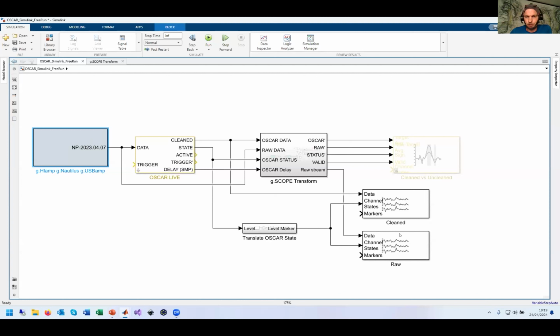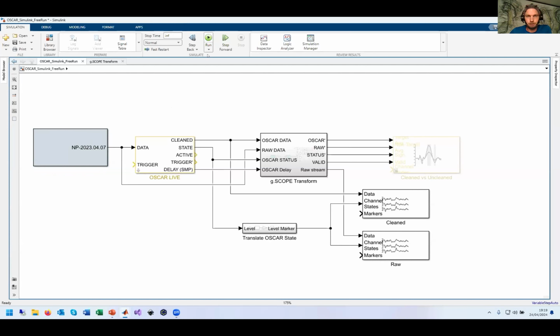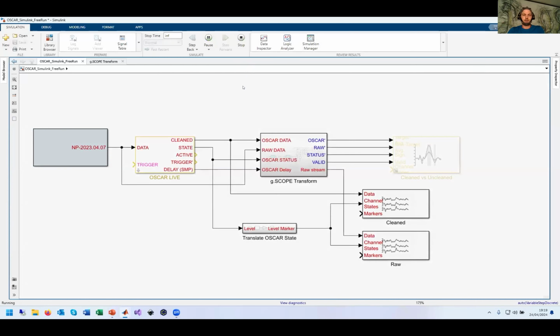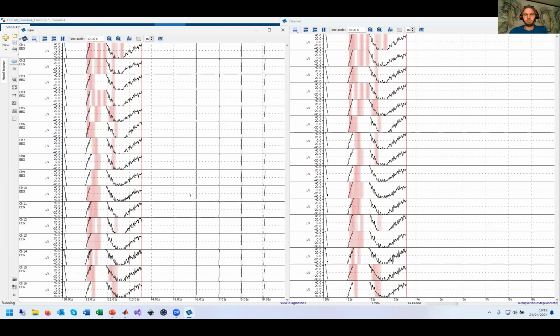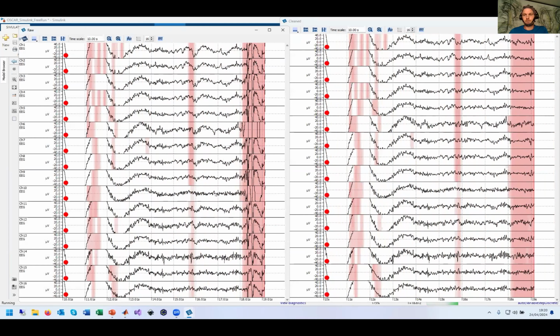Here everything is happening in Simulink. We have two output scopes with clean and with raw data. And I will start the model now. I tried it with screen capture, it works. Let's see if it also works with screen sharing. So I will stay very silent in the beginning. Nice.